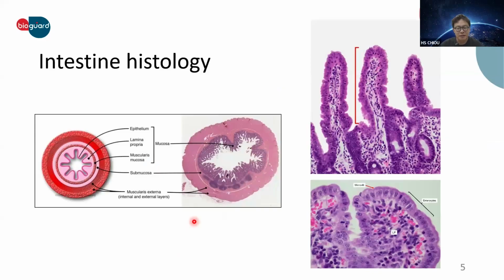Before we talk about disease, we need to remind ourselves what normal looks like. The intestinal mucosa is not just a layer of cells. It's a highly organized immune organ. We have a villi architecture here, a crypt structure, lamina propria, some lacteals, and an enormous immune cell population. Even in normal dogs and cats, the intestine is full of lymphocytes. So when we say lymphoplasmacytic enteritis, we must ask, how much is too much? And that's where interpretation becomes challenging.